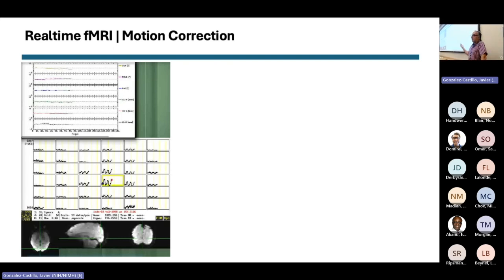So halfway through a scan we can stop it and say to our subject, hey, please remember you have to be still. And it's much better to stop it and start again than three days later, when you open your data set, realize that half of it you have to throw away. I might still tell them they don't care, but you have a chance to try.